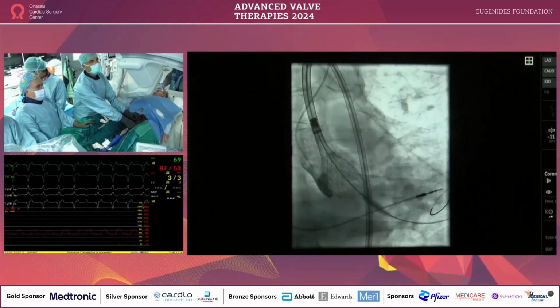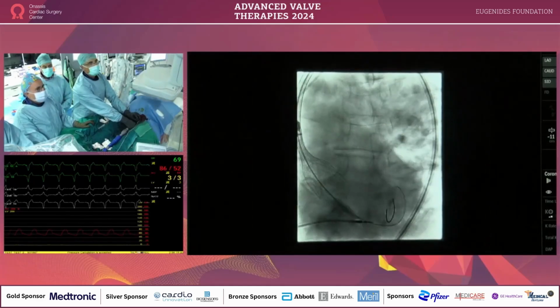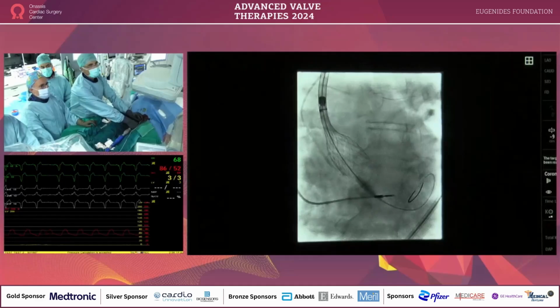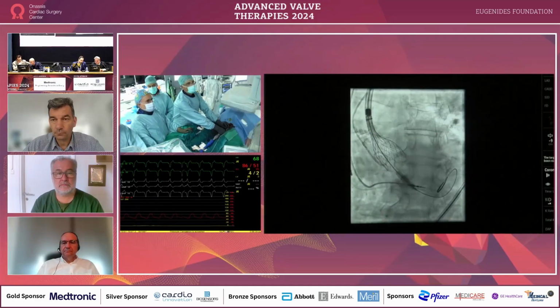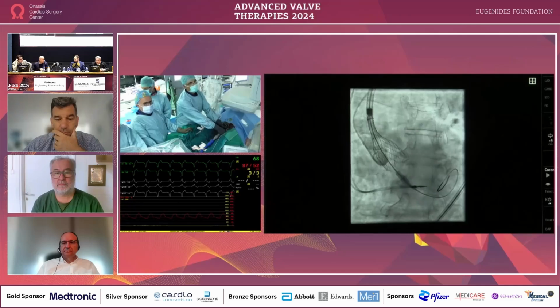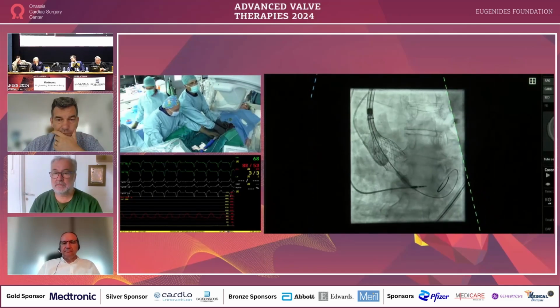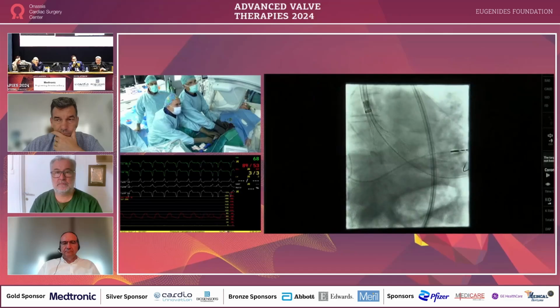Well, as we said before, given that there is a pacemaker already, there's a lot of movement up. We accept 4 millimeters below implant. It's good. So, hemodynamic wise, probably a 6 I would be happy with this. No problem. It's okay.